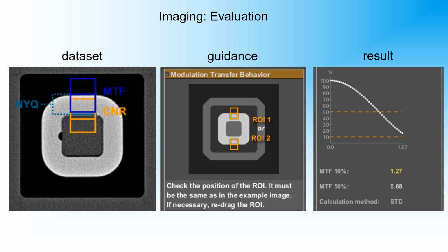The calculation method standard is adopted from the mammography standard. We have two others. One is from the dental standard, or DIN, which is a simplified way of finding an MTF, and a self-developed pre-sampling MTF that we also included in our software.